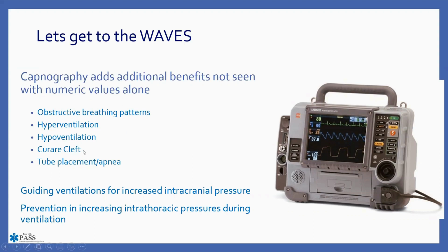The other ones, it is certainly capable of doing that, and we're going to look at a waveform that kind of shows each one of these. But from a legal aspect and keeping yourself out of hot water, the tube placement and apnea is really what you need to be focusing on.